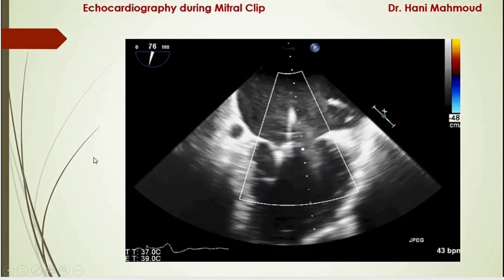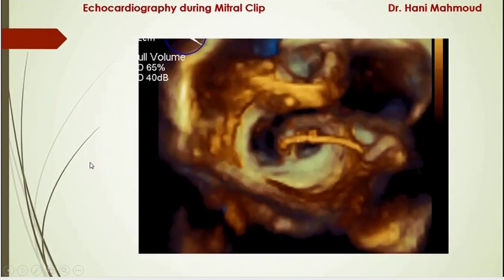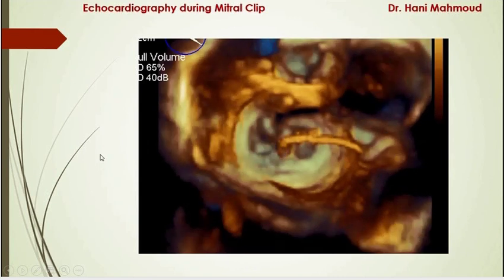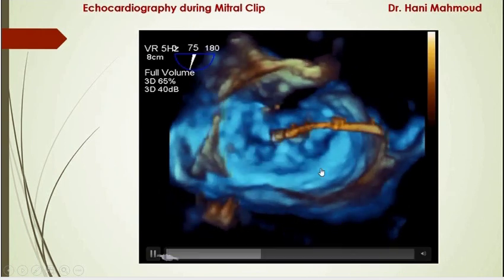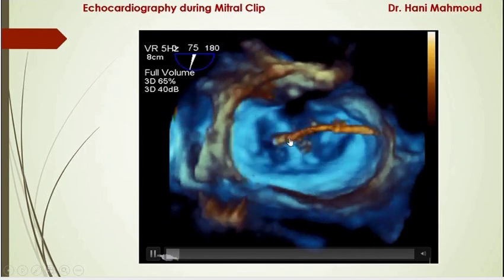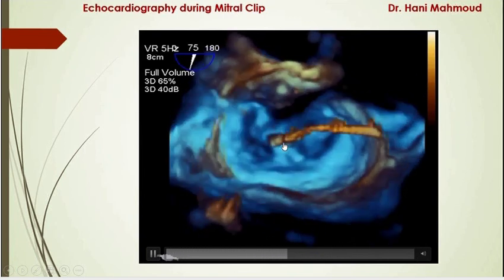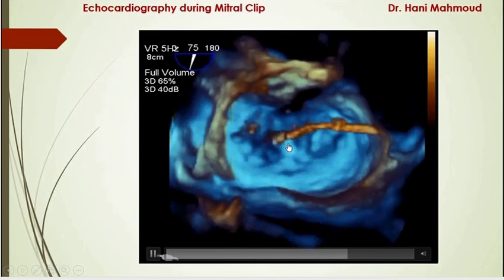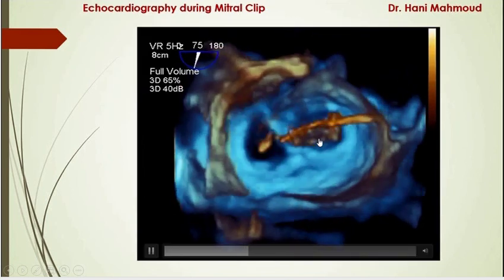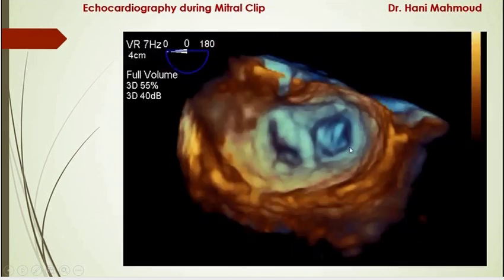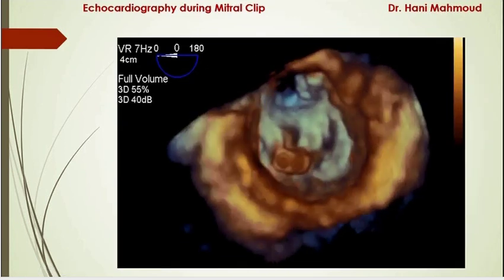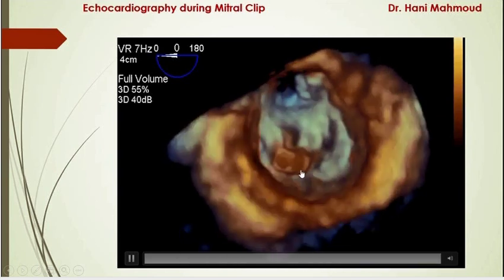We also optimized the heparin dose and ACT to overcome stasis. After obtaining a satisfactory result, we asked the interventionist to release the second clip. Once released, he withdrew the remaining system through the sheath — this remainder acts exactly like a needle and can easily harm any part of the left atrium, so it must be followed carefully. The final view from the left atrial perspective shows a double orifice mitral valve. From the left ventricular perspective, we can see the tips of the two clips, with the medial orifice and lateral orifice both visible.